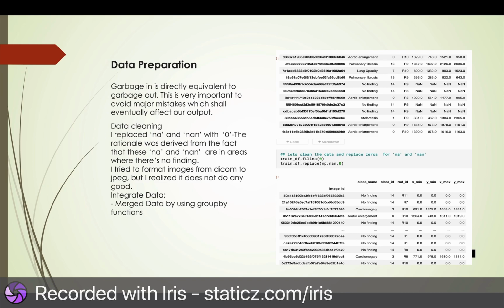But I realized that we kind of use the same code, the same command, like in other areas. Like here, this is a CSV file of images, which are showing those kind of abnormalities.